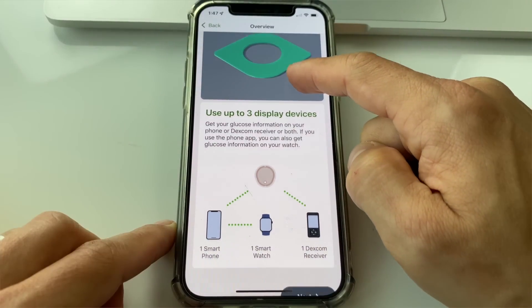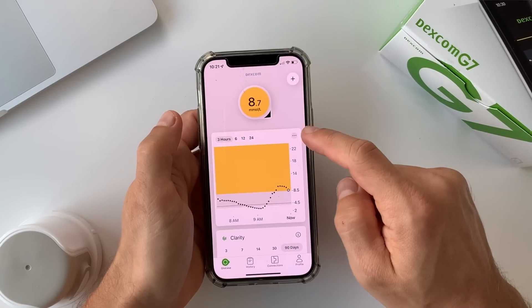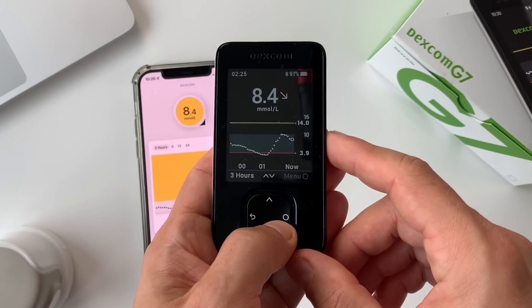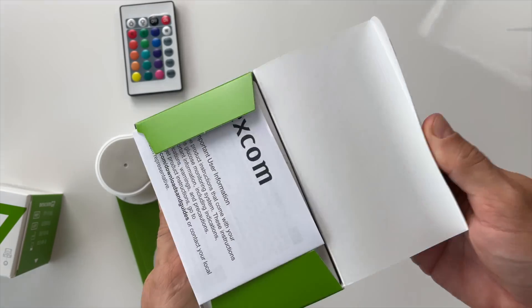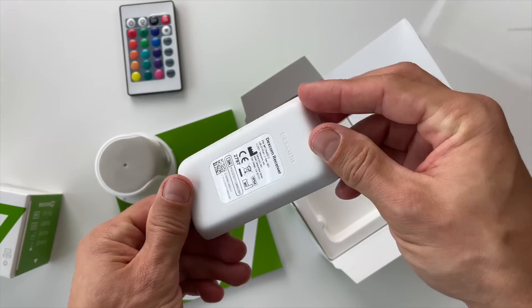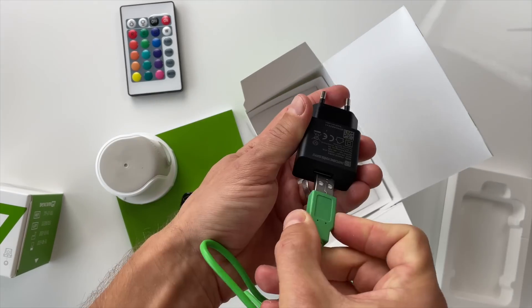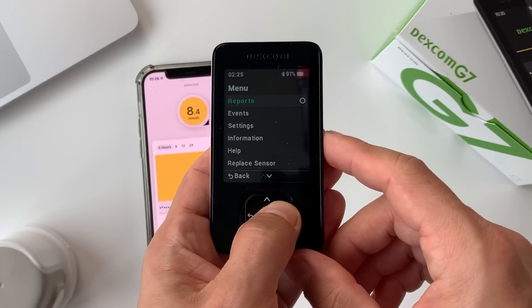The G7 can pair with three devices: your phone, your insulin pump if you're using one, and the G7 receiver or your watch. The receiver has a bright green cable, feels really nice in the hand, and is very light. I really like it, and I'm sure you'll like it too if you choose to go with the receiver.